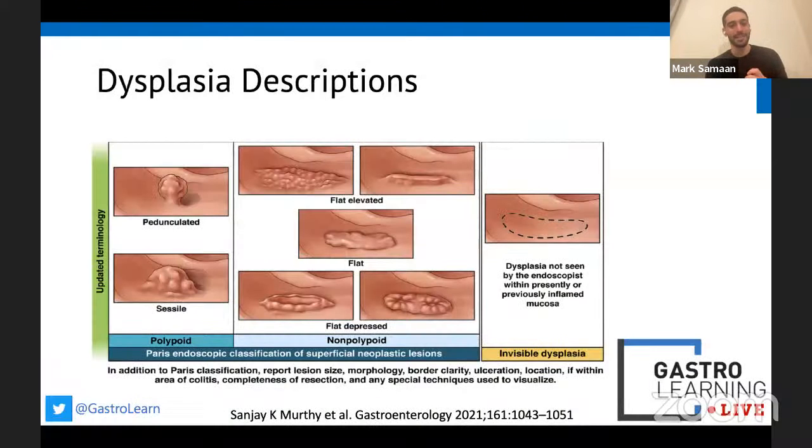We're not all quite that special, but I guess again it comes back to looking really carefully, taking time. If you see something you're not sure about, I think, to be honest, the right thing to do is, if it's easily resectable, you can resect it. If it's not resectable, you can take a biopsy of it. I think we do worry a little bit about biopsying lesions and making them difficult to resect later on. But I think if you're in two minds, it's really hard to tell someone, I'll just leave it alone. So I think the right thing to do is take a sample there.